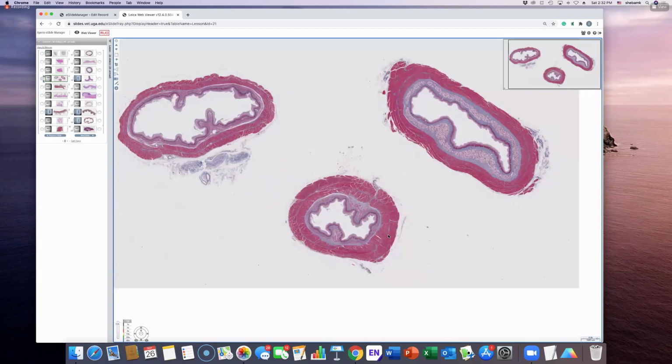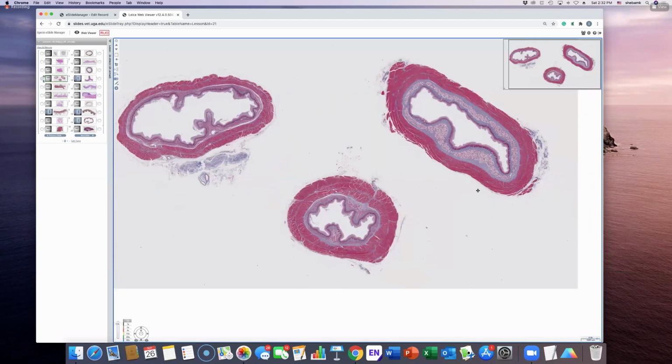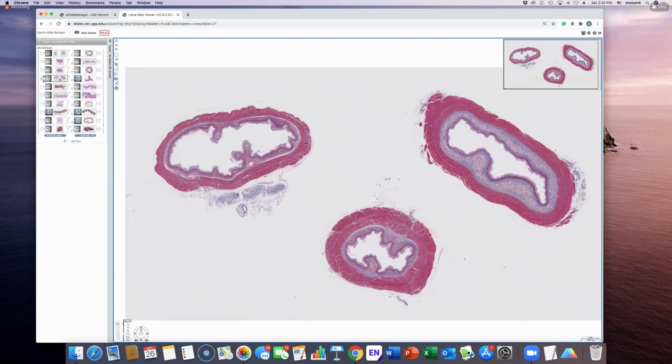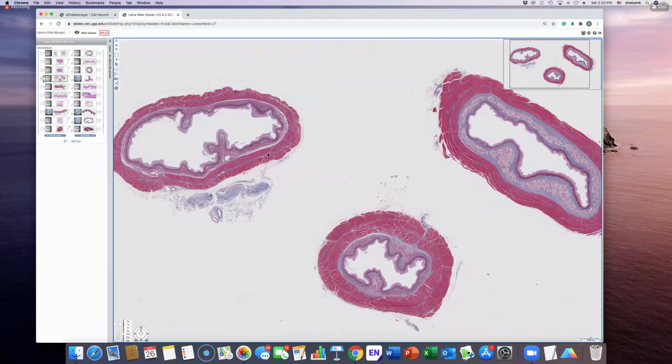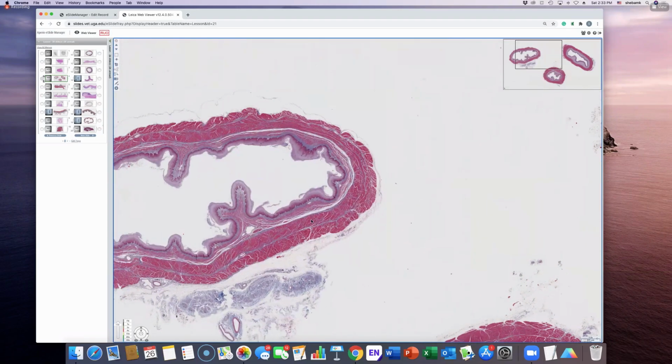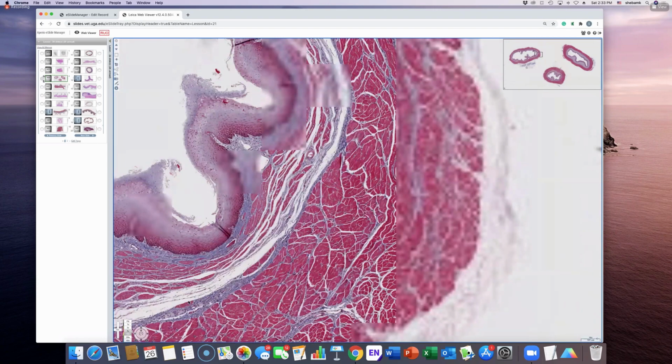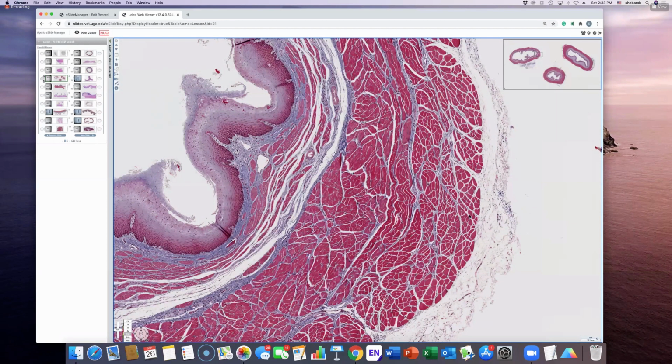So this is a tubular organ. If it's going to be a tubular organ, it should have serosa or adventitia, depending upon where it's running. But the wall structure should be divided into tunics. So tunica what? Tunica mucosa, submucosa, muscularis, and then the adventitia or serosa.